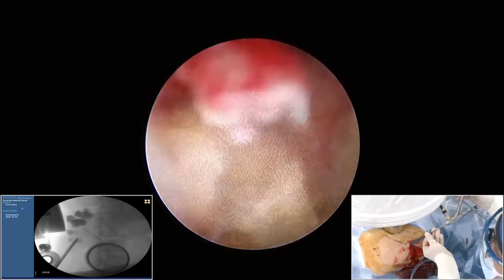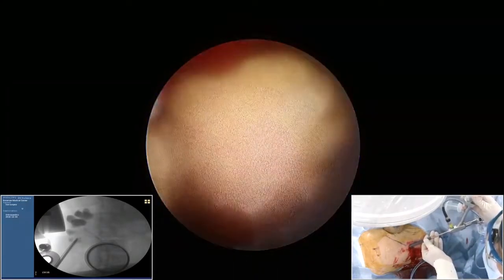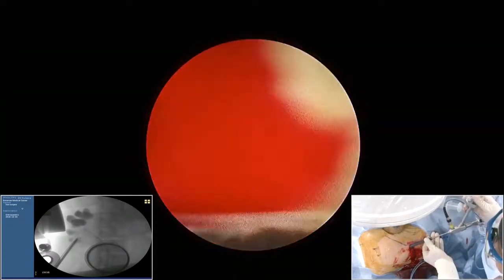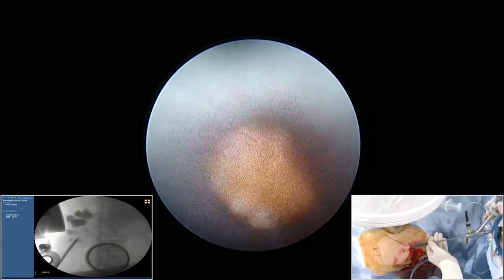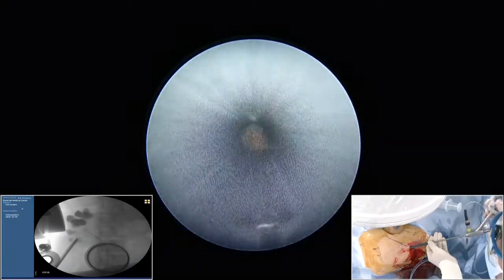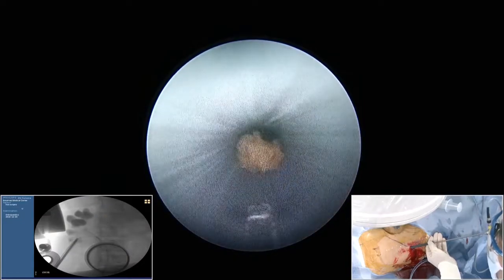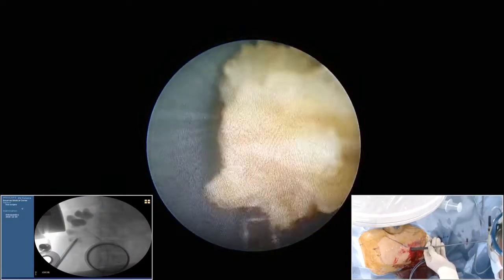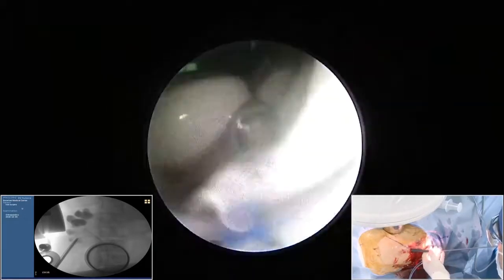So I wanted to increase the efficiency, so I removed the working guide wire, the super stiff, because I have another safety guide wire. Now it goes out. If it doesn't go out, I do the laser firing just in front of the stone, then it can facilitate the stone moving outside the body like this.